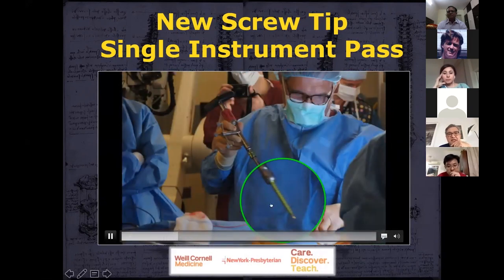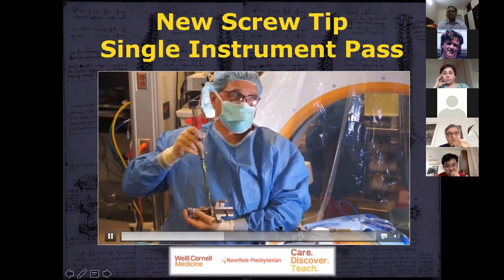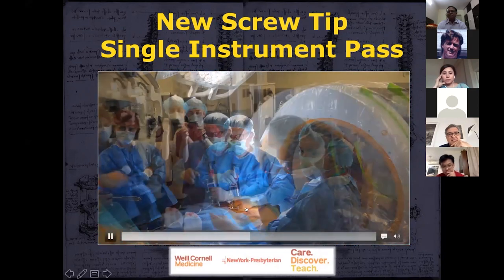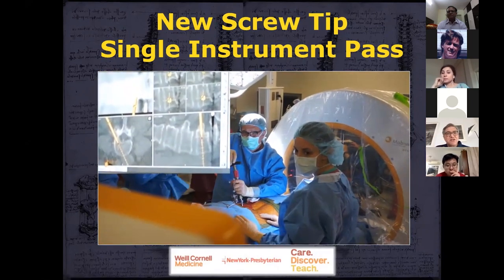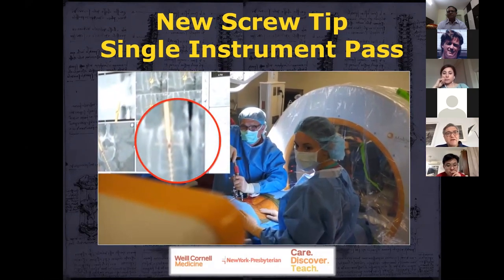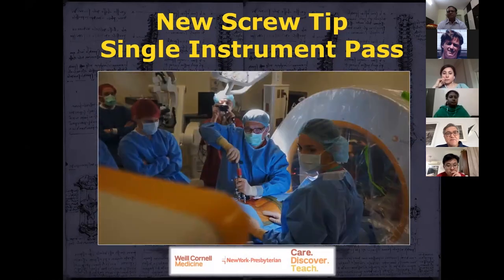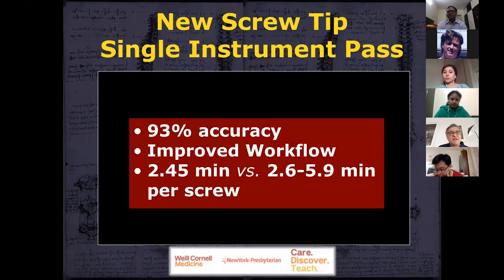It's navigated, as you can see here. That's the tip of the pedicle screw, and we register it for the navigation system. We have a small skin incision here. We tap, so the K-wire that's sticking out attaches to the bone. And then we insert the pedicle screw under direct navigation. You can see here that you really have to obviously make sure that you penetrate the bone. So we've used this pedicle screw now maybe for a year and a half or 2 years, and we've been very happy with this. Every pedicle screw takes about 2.5 minutes and is very accurate overall.